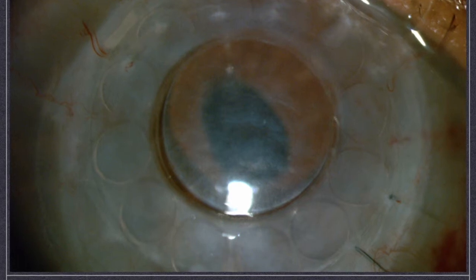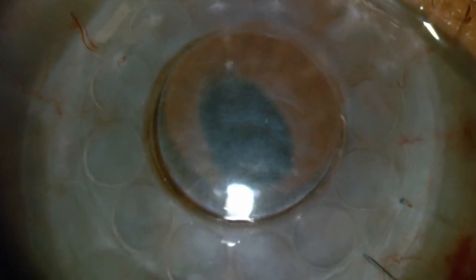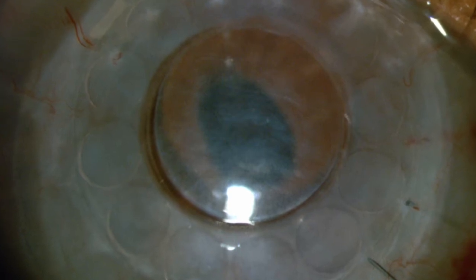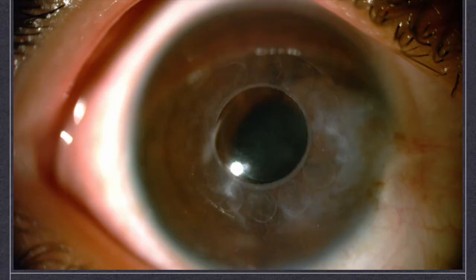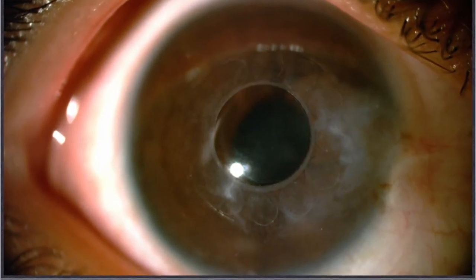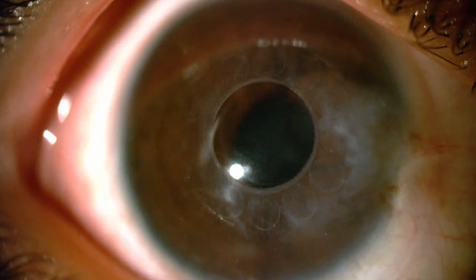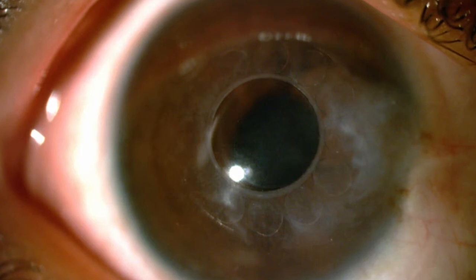Here we see a case of a Caraclear XT that was placed into a failed corneal transplant. The patient was able to achieve 20/40 vision. Here we see the use of the Caraclear XT in a case of corneal scarring. Note the clear central cornea after replacement of all of the scarred tissue by the Caraclear XT.